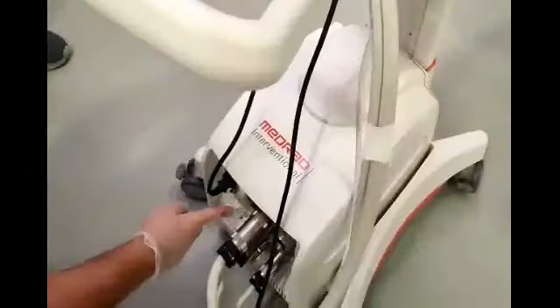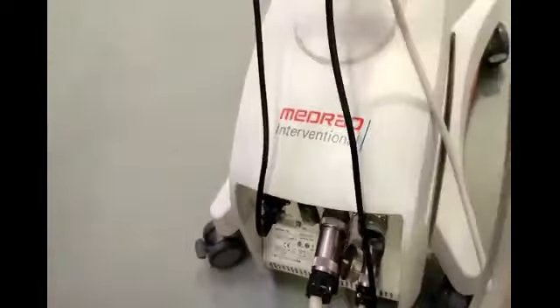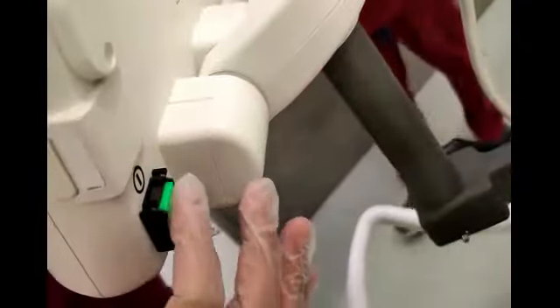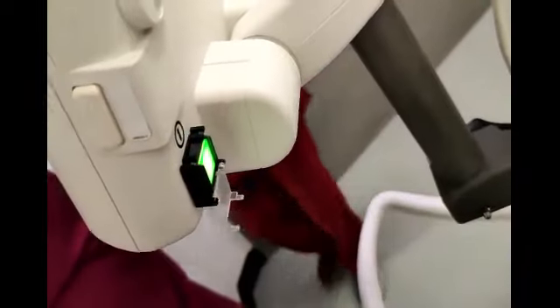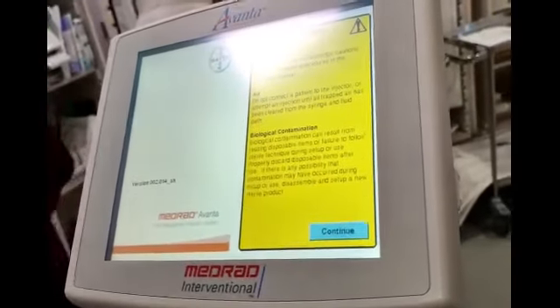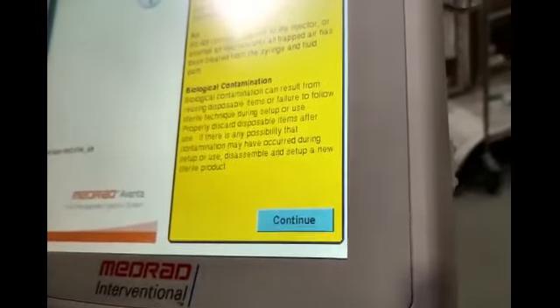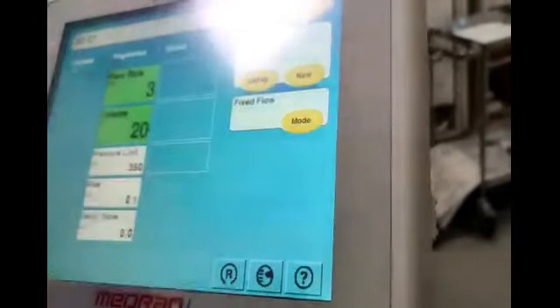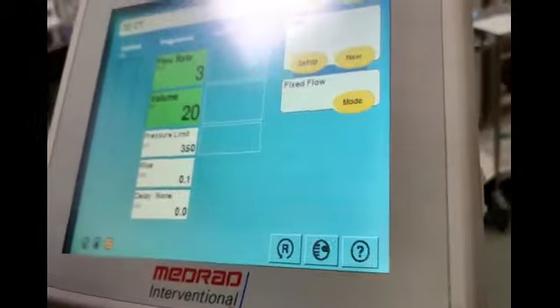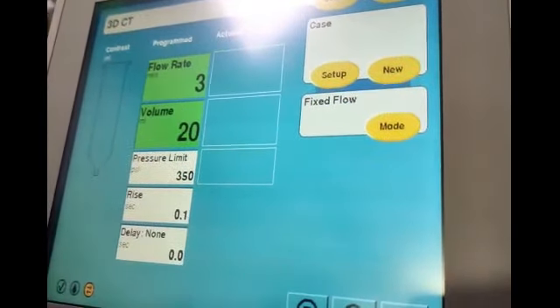I will show you how to use it. First of all, there is a main power button — we'll turn it on from here. Then there is another power button for the main supply, and we can also turn it on from there. Just press it and it will be turned on. Once it's turned on, it will give you a message with safety instructions and warnings — then just press Continue.